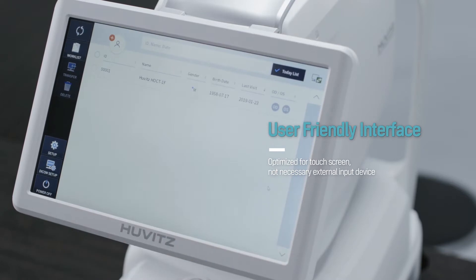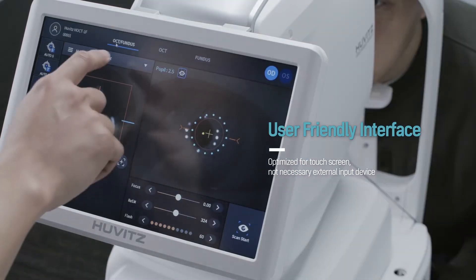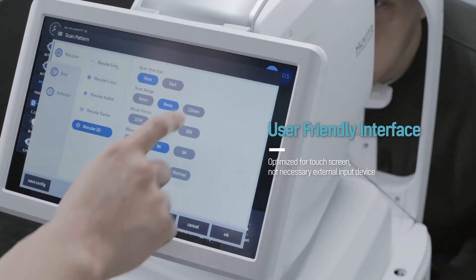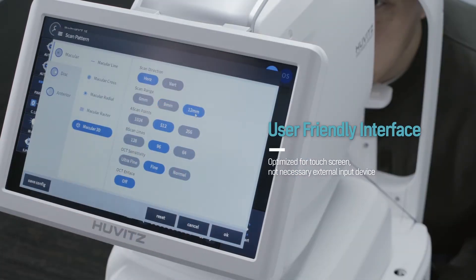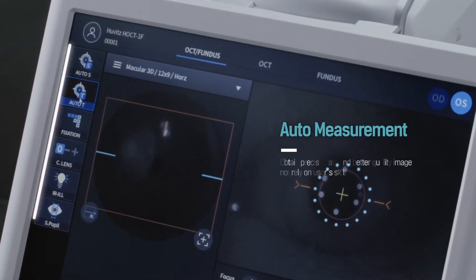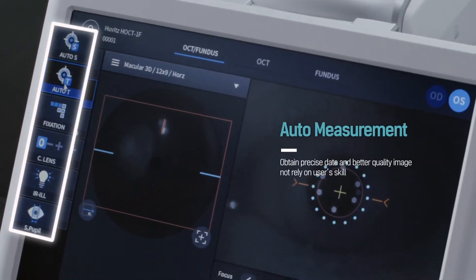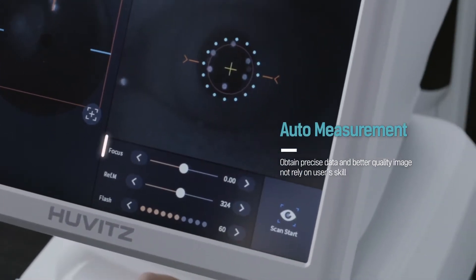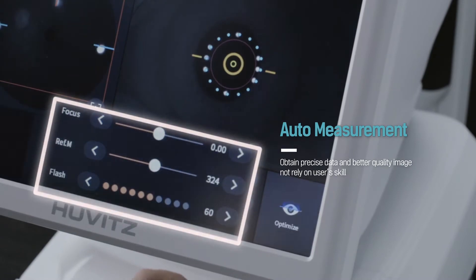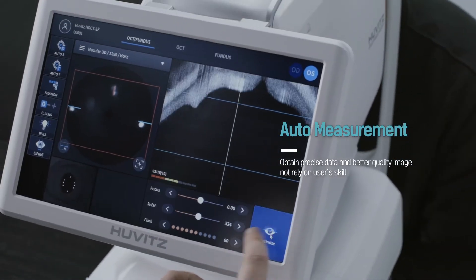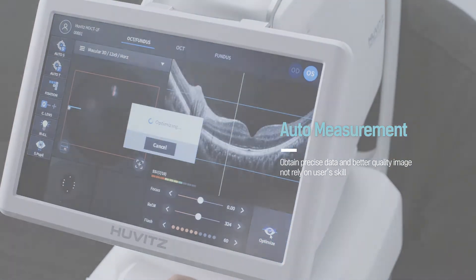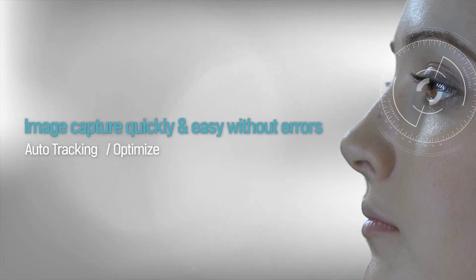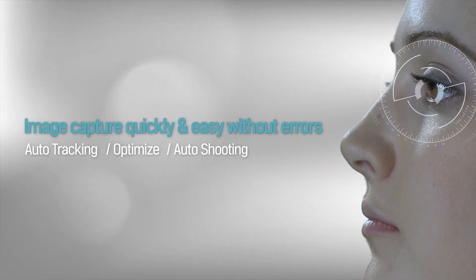Huwitt's OCT is easy and intuitive by concentrating users' perspective with an accurate user interface system. It provides fast and accurate images by auto-tracking, optimization, and auto-shooting.